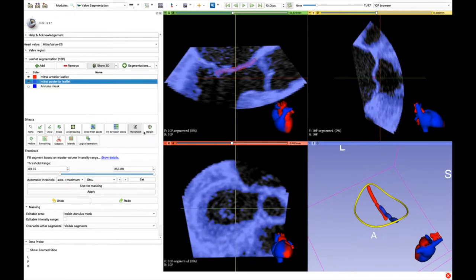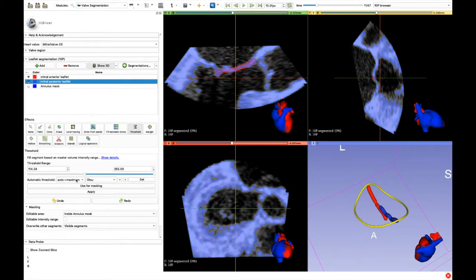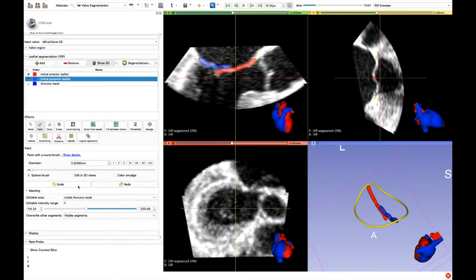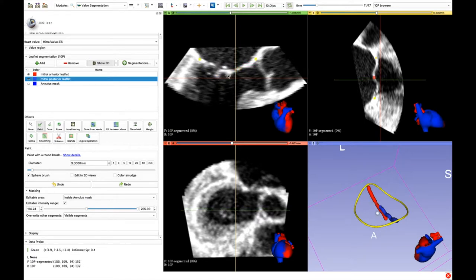Another option is to use the threshold paint. We set an appropriate lower threshold to get rid of the noise and confirm the choice by clicking on Use for Masking. This way the brush will paint only the pixels within the thresholds and we can use a bigger brush, allowing us to complete the work in less time.